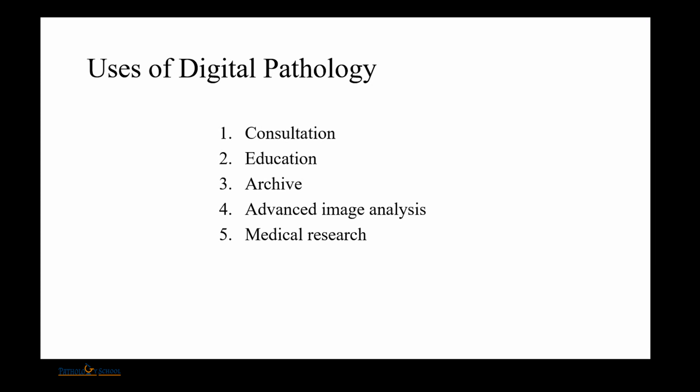And you can use it for CMEs, conferences, multidisciplinary tumor boards, and clinicopathological conferences. You can use this for archiving your slides, since glass slides require more storage area. Especially in those cases where we have a biopsy with only one slide, we can scan it and keep it with us, and we can give the slide to the patient.